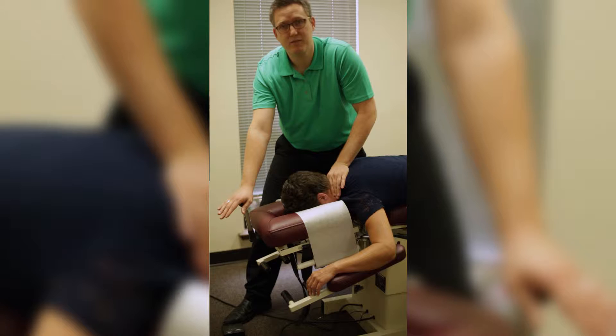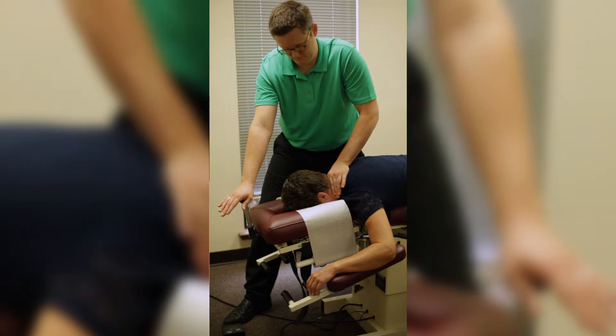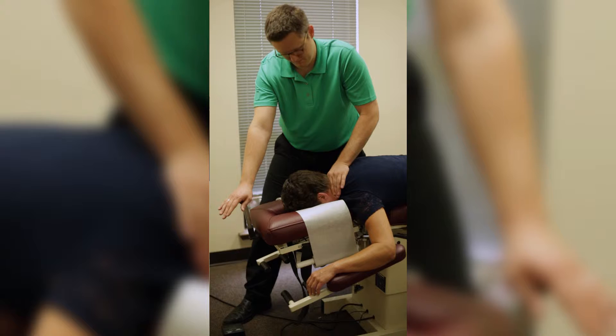This is what Cox Flexion Distraction looks like when applied to someone's cervical spine. As you can see, Cox Technique is gentle, it's smooth, it's rhythmical, it's doctor-controlled, and specific level applied.